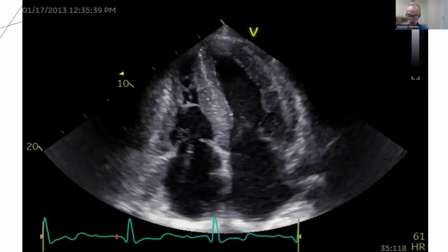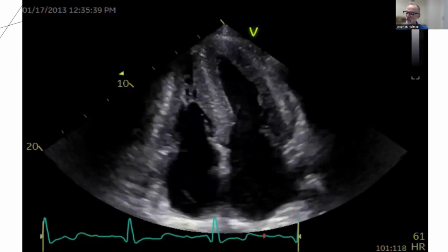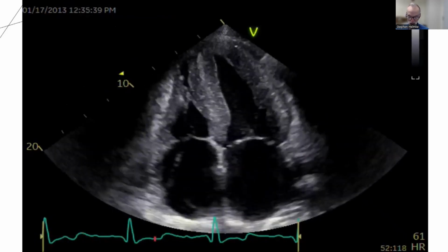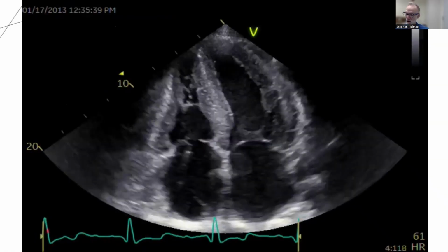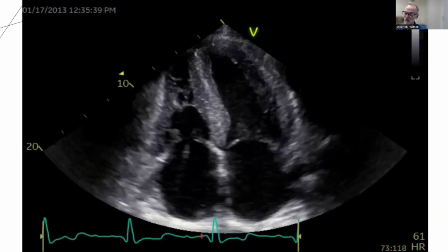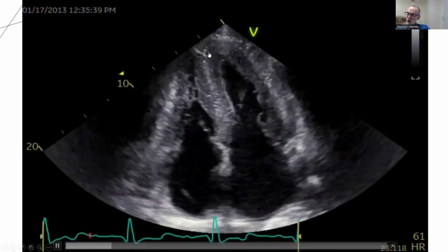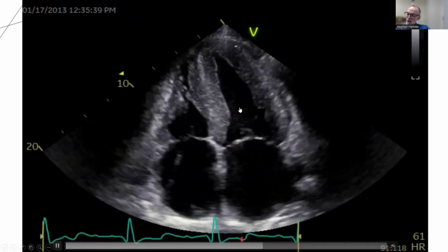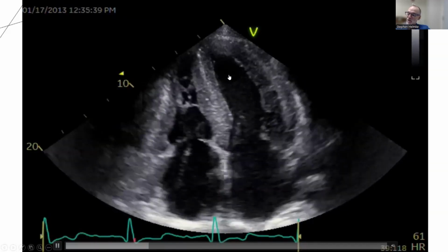Take a break from all the explaining and just watch as this heart beats. This is a heart with amyloidosis, and as you see, in this case, the front rooms here, the atria, are not really all that much smaller than the back rooms, because these atria swell up because, again, blood doesn't get effectively into the heart as much.